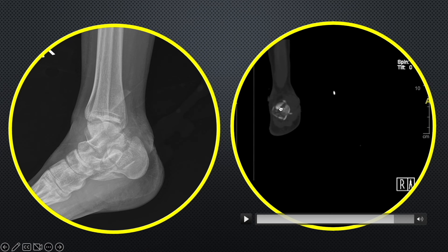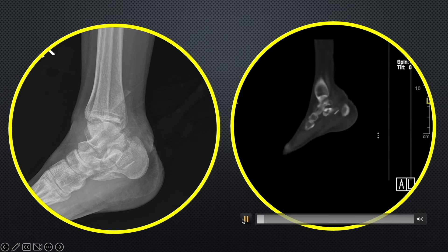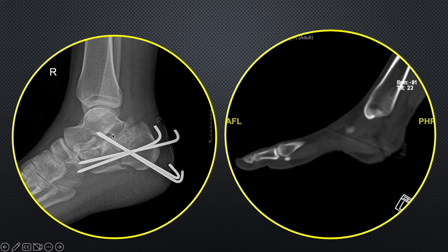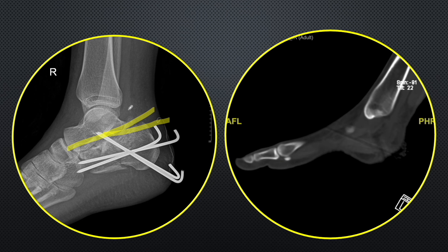Here you see the posterior facet is lying downwards and is not related to the talus at all. Now coming to the fixation done: the posterior facet is still displaced, lying downwards. This part is the comminution zone and this part is the tuberosity. The relationship between the tuberosity, posterior facet, and the talus is not good. If you draw the Bohler angle it comes out to around 4-5 degrees — that is not good. The Gissane angle is also increased. So overall the reduction is not satisfactory at all.